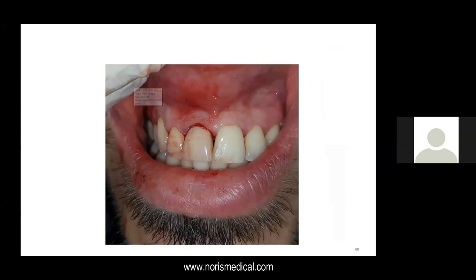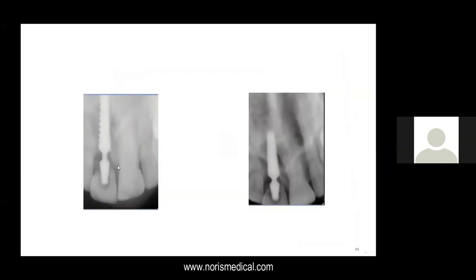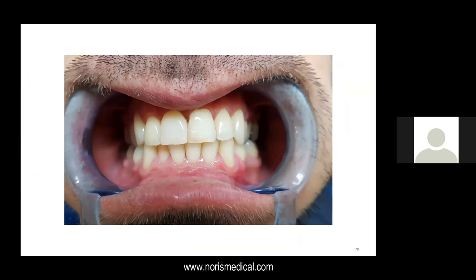So the patient was very happy with that. And I think everything worked good. But after a year, I told him I cannot really give you back the tooth because after all, I used an acrylic resin in order to do that. So we did the final crown. So this is the temporary. Here you can see it doesn't sit very good actually because it's acrylic and it is his original tooth. And this is the final result, tooth number 11. I think that the result is relatively satisfying.